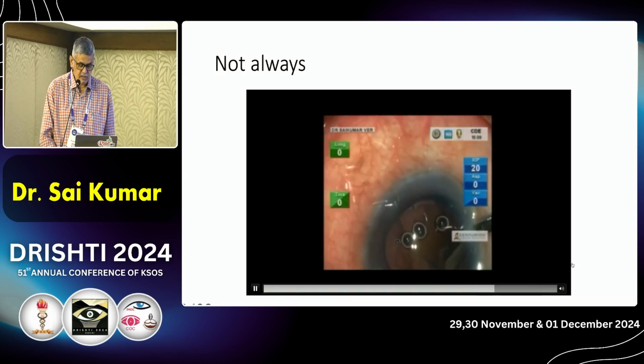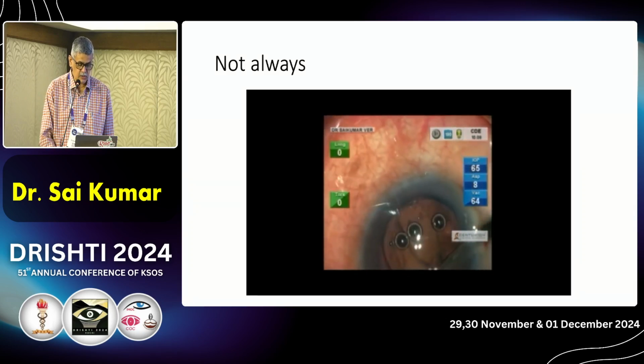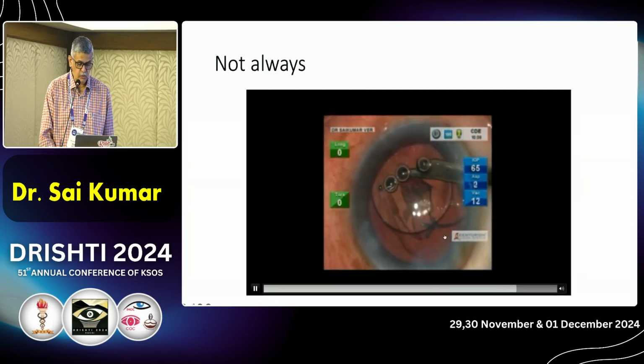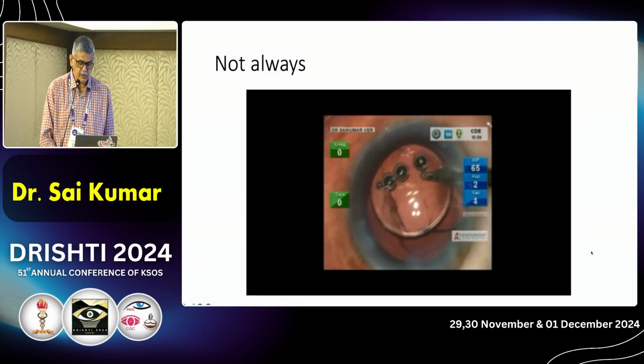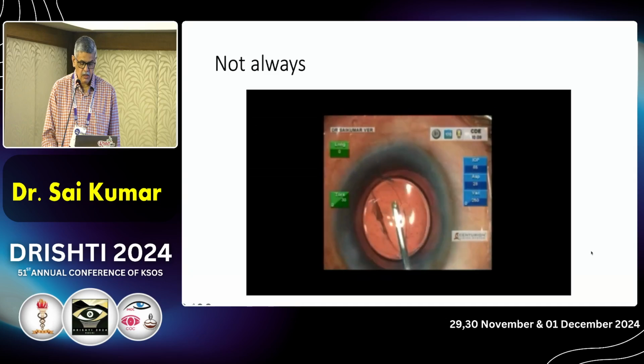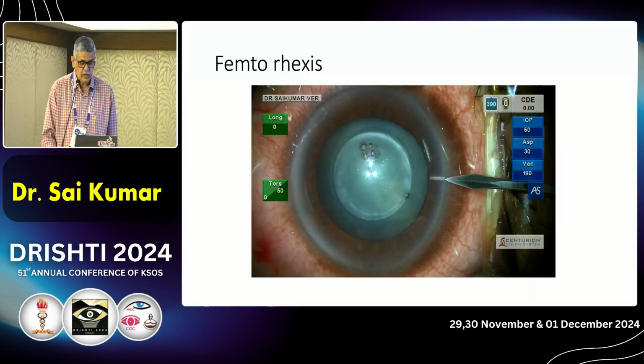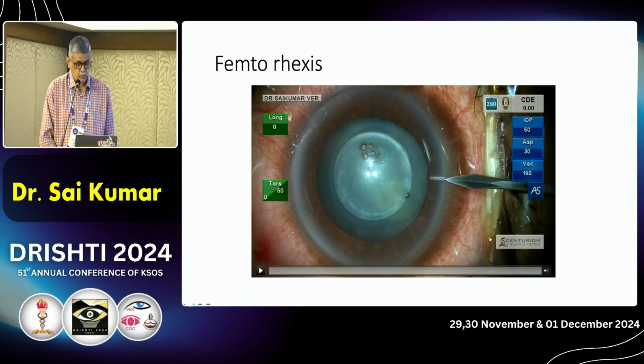There is no vitreous there. I have not done an anterior vitrectomy. There was a small piece of cortex remaining. I went in with a Simcoe cannula with very low irrigation and removed that piece of cortex once the intraocular lens was implanted. So maintaining the chamber is extremely important in all posterior polar cataracts.